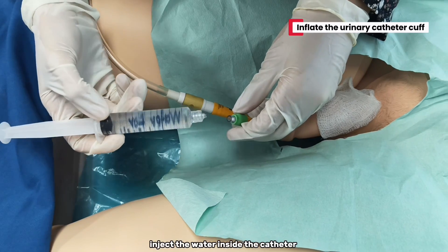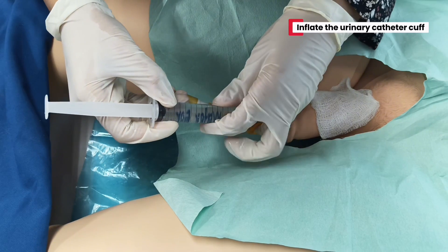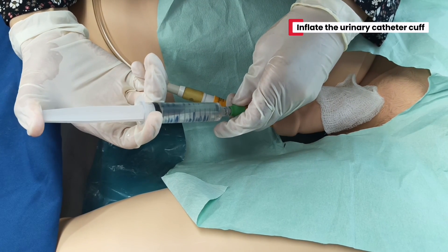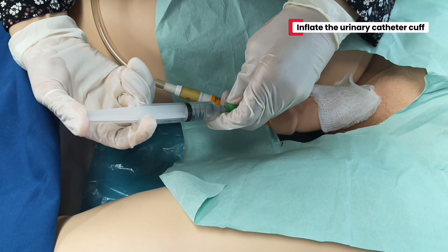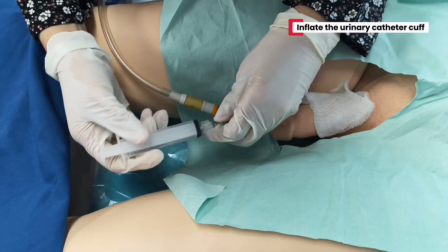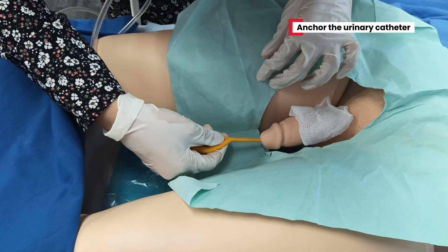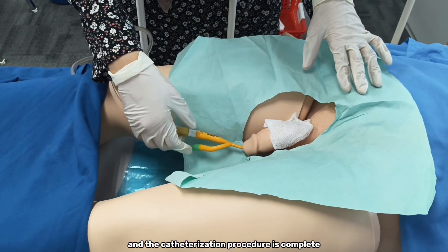So now I'm going to inject the water inside the catheter balloon. I will pull the catheter back a bit. And the catheterization procedure is complete.